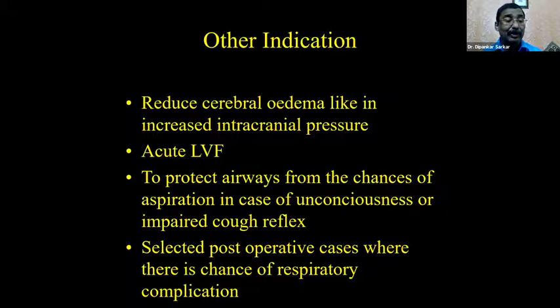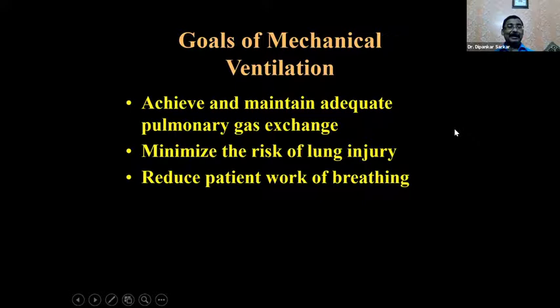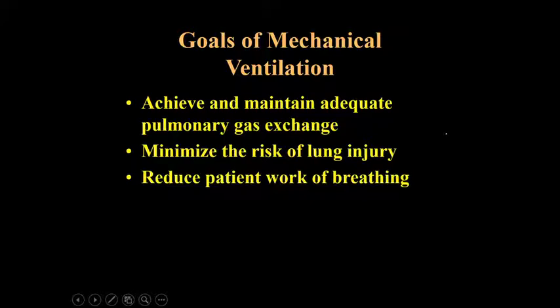Selected postoperative cases, when we want the patient to be sedated and ventilated so that nothing wrong happens to the basic operation, right? Goals of mechanical ventilation: the primary goals are to give a good amount of oxygen, wash out the carbon dioxide, and give the patient adequate rest. That is, reduce the work of breathing and optimize the patient's comfort.